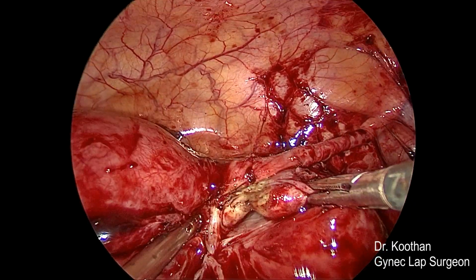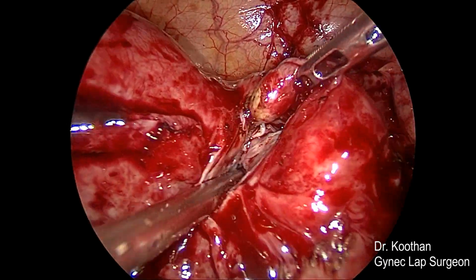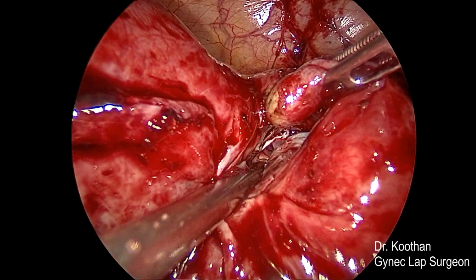Slowly dissecting it from the uterine adhesions. You can see the pus coming out of the tube.